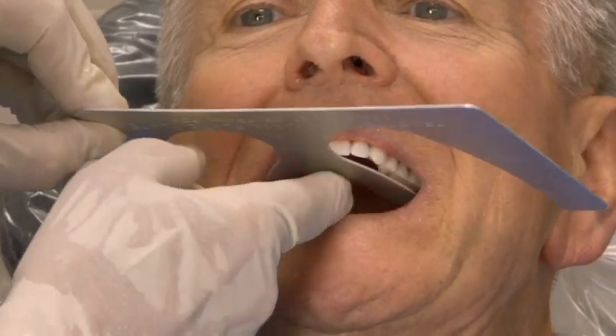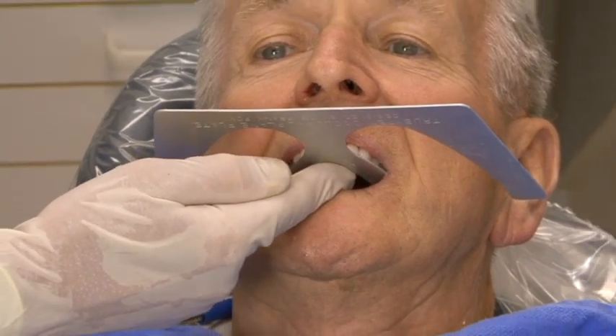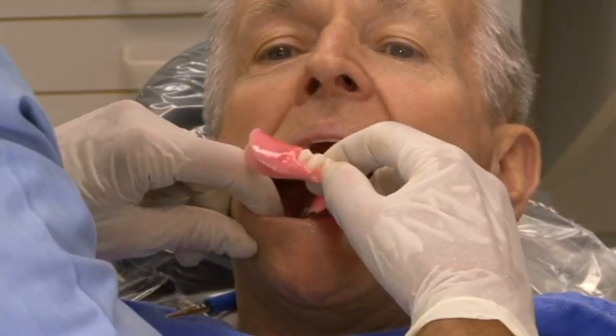Let's make sure that we have the posterior teeth in there. We can use our Fox plane to make sure that our plane of occlusion is level — I think that's critically important. Then we can slip these in there.